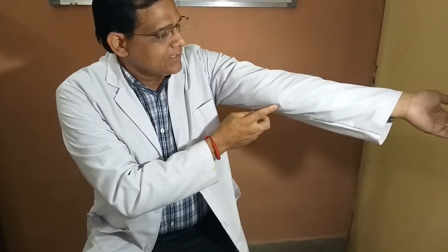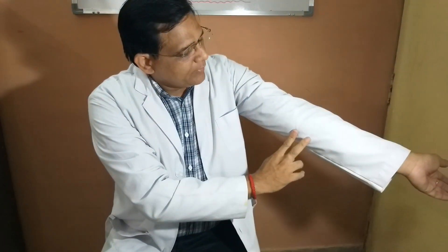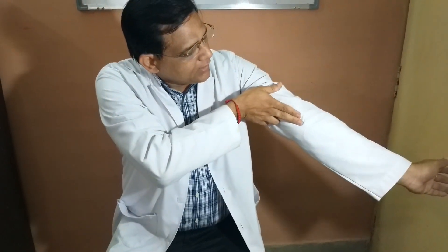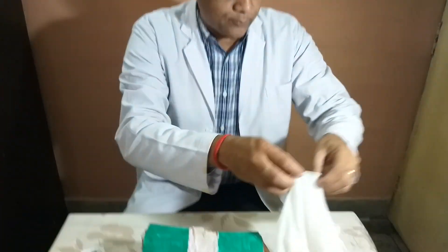To locate the site at the ankle, you just feel for the medial malleolus. From here you go two fingers above, and from there you go two fingers laterally. So medial malleolus, two fingers above, then two fingers laterally — this will be the site where you will easily find your vein.